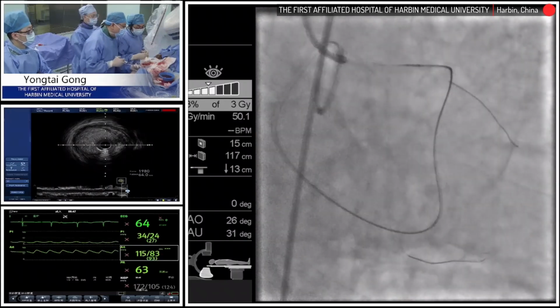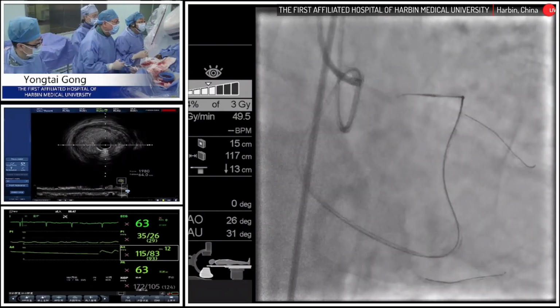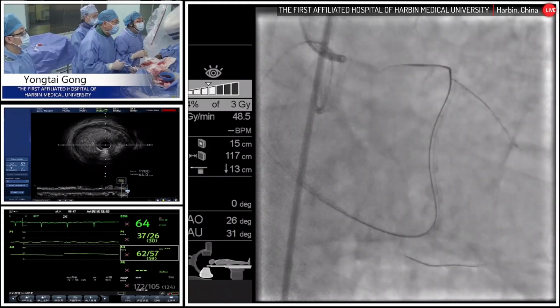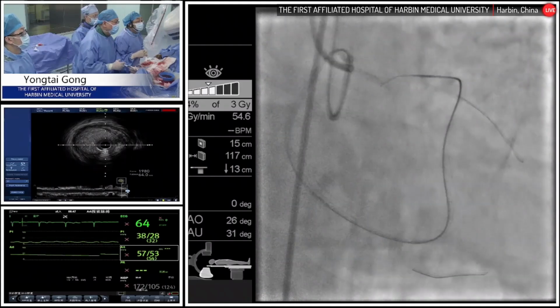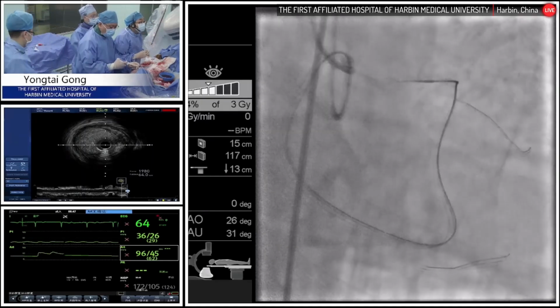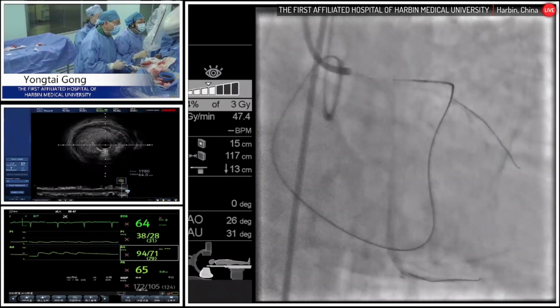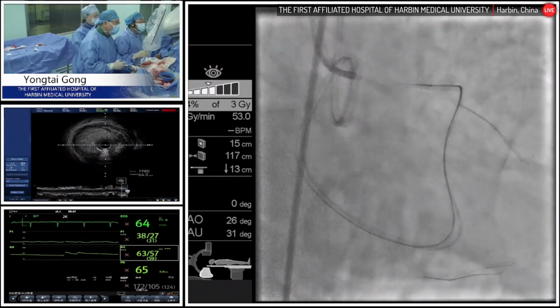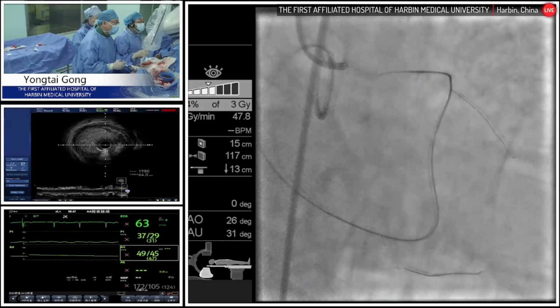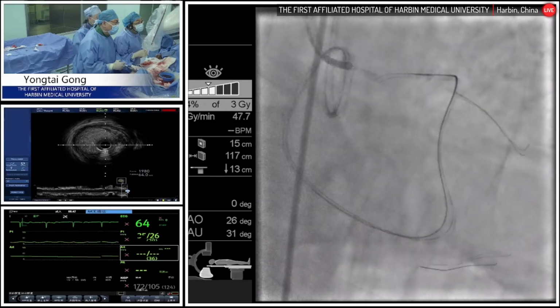Contrast. Okay, we can see that the retrograde Gaia Third is attempting to make the puncture. How about a little contrast? Okay, I think the direction is relatively okay. How about we try the spider view or something?